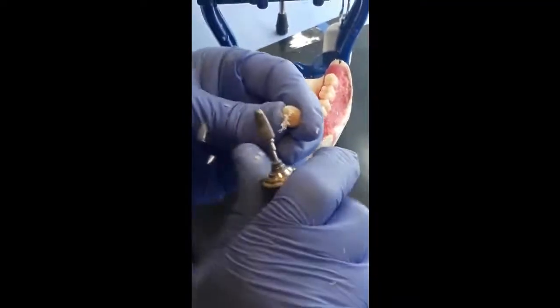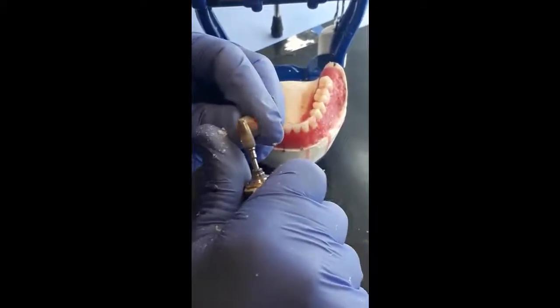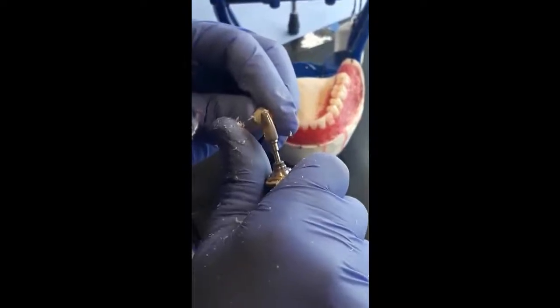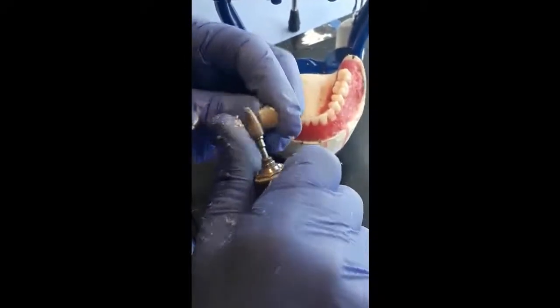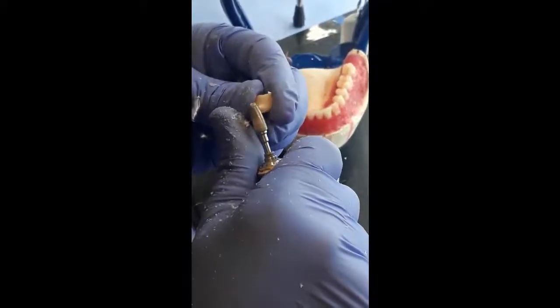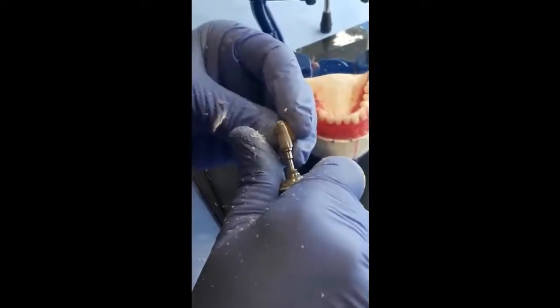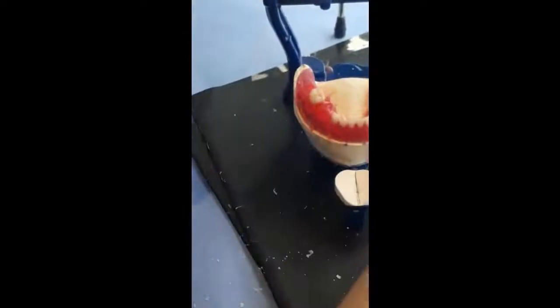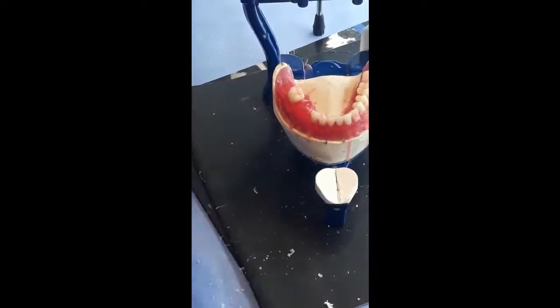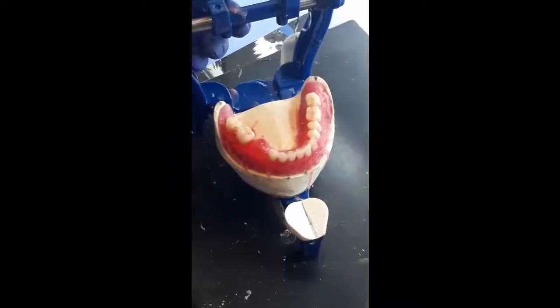You have to grip the tooth firmly between your two fingers so it will not move. Okay, a little bit. I fix it in its place.